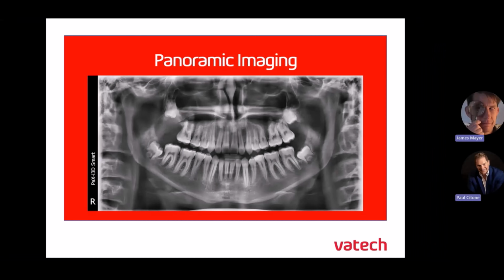So Jim, why don't we talk about some fundamentals of patient positioning and common things that can occur in your images? That sounds great, Paul. We just finished our patient positioning portion, and now let's look at images. On screen here, I would consider this a high quality image. I've got clear anteriors, a nice smile, and my condyles are straight up and down. So the question is, what do we look for in pan image quality?